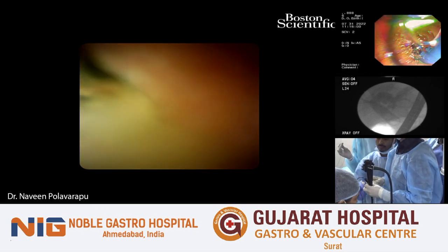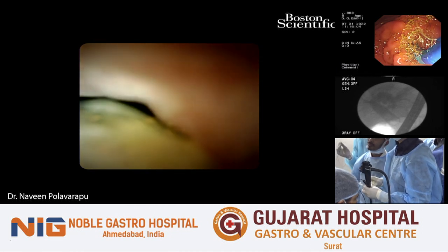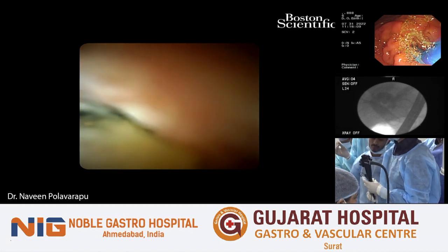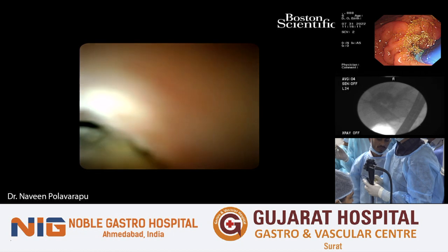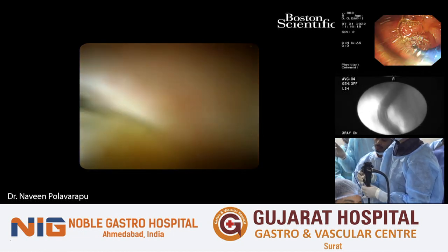Okay, so I'm sure a lot of you use it as a single operator. I tend to do both the movements by myself, both the spy scope and the duodenoscope. I'm just flushing right now to get a better view of the stone.